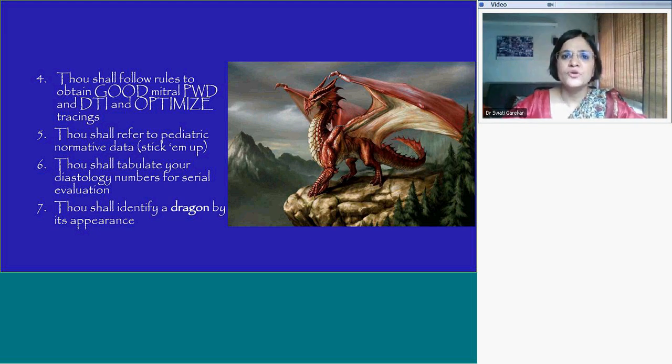Don't be confused by the data that you get that doesn't fit in. Recognize that there's diastolic dysfunction. There's bound to be diastolic dysfunction when there is reduced ejection. Don't shy away from diastology if your indices don't add up. I encourage you to understand it further.